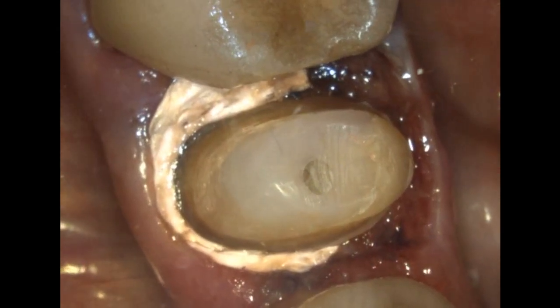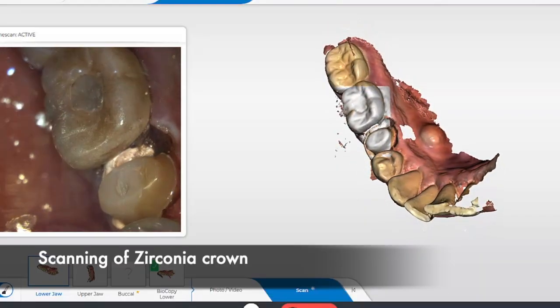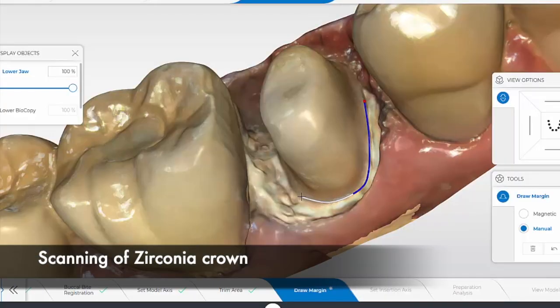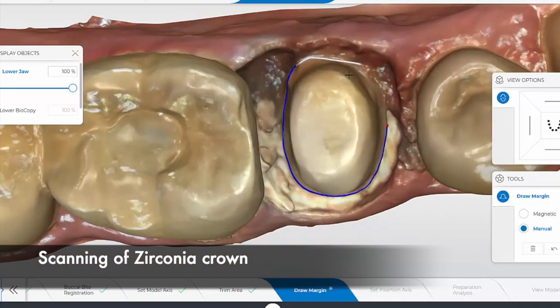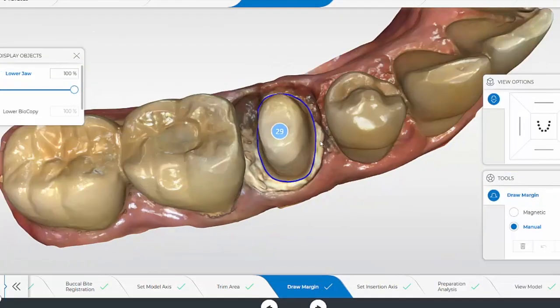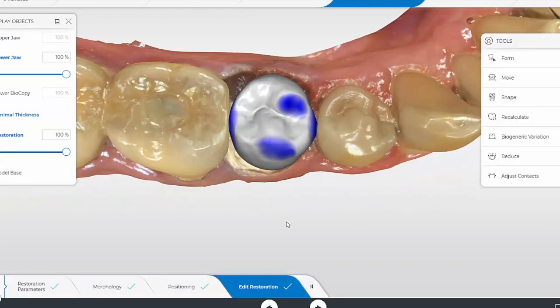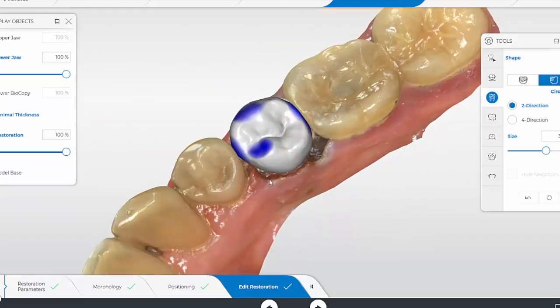Here you can see all the margins have been prepped. I try to keep my preparation as conservative as possible because we don't have a lot of tooth structure. Once the preparation is done I leave the Teflon in there — as you can see I'm scanning with the PrimeScan right now. There is no bleeding whatsoever, and the Teflon acts as a separation between the tissue and the tooth, also helping with margination. I hope this video was helpful on how to create a post and core with buildup material for compromised cases. Keep CAD CAMming.